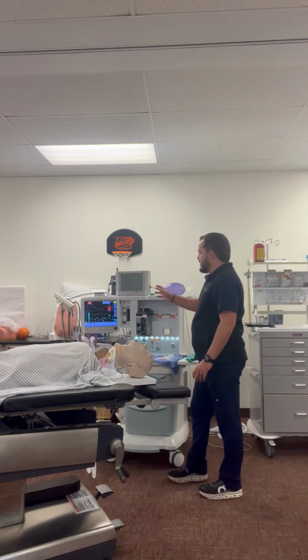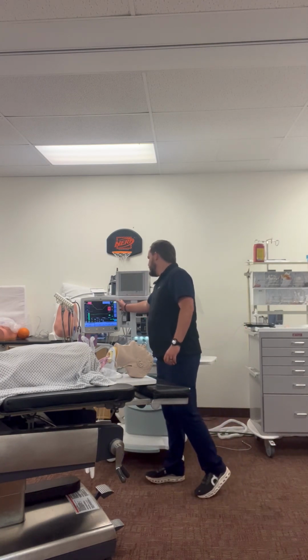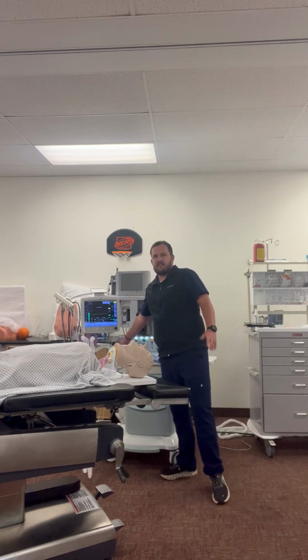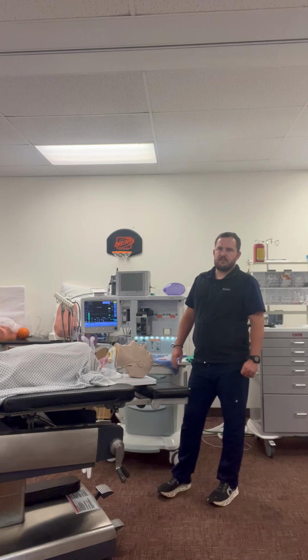Completed that, I have all my equipment ready. I have suction, I have my EKG, I have my blood pressure and SpO2. And I also, by doing the high pressure leak test, check the scavenging system. So the machine check is good and ready to go. I'm good to go get my patient.